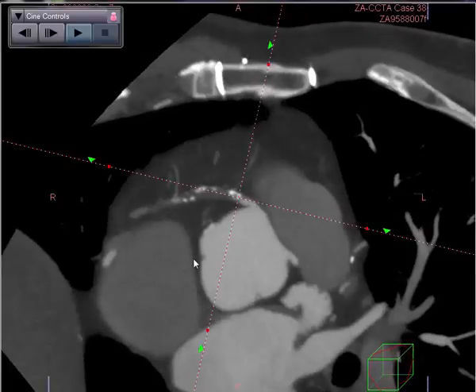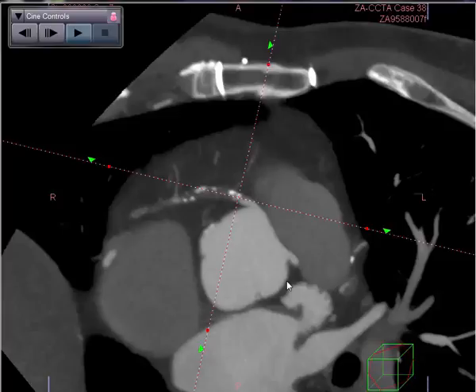So we have a patient with chest pain and three bypass grafts. One of them, going to the obtuse marginal, appears to have eccentric, non-calcified but obstructive plaque in its mid-portion. This patient should be referred directly for angiography. This should be relatively straightforward — angioplasty and probably stent placement without any other complications.